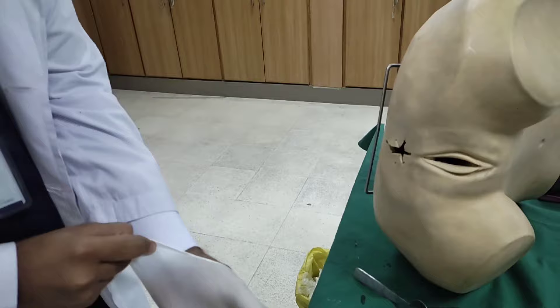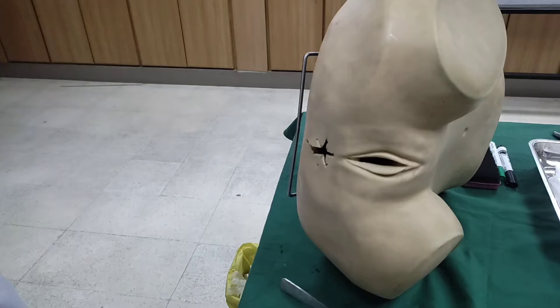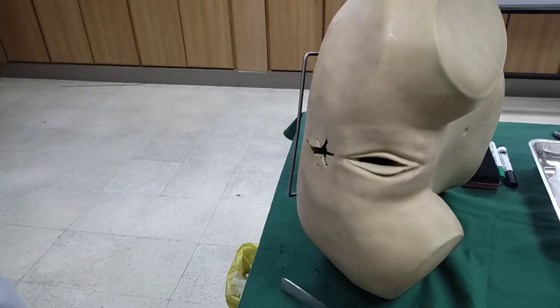After that, we have to start our DRE properly. For that we have to wear gloves. On the right side, we have two gloves, because obviously if you have nails the patient will have problems with this. And on the other hand, we have one glove.